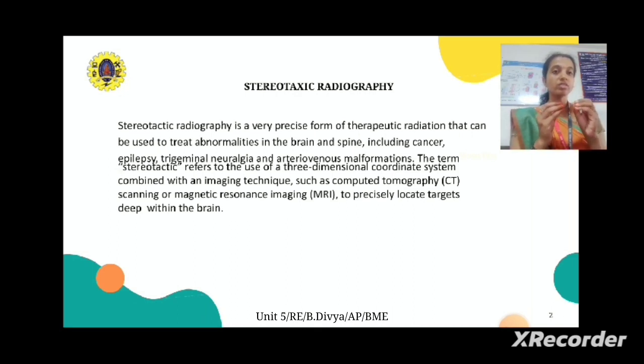Since this is specifically for brain and spine abnormalities, we can use CT and MRI scans to locate the targets.